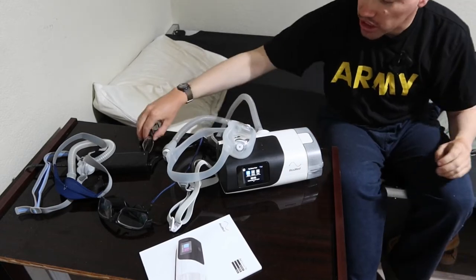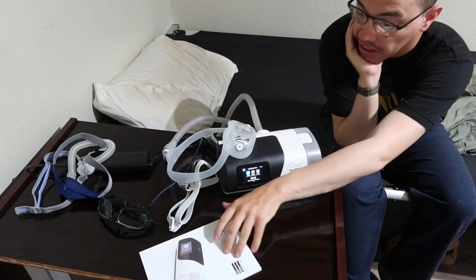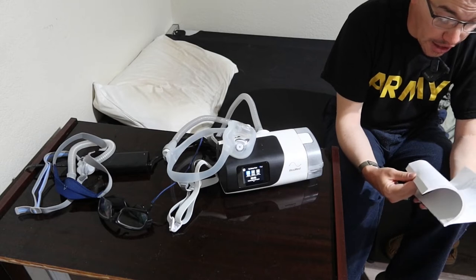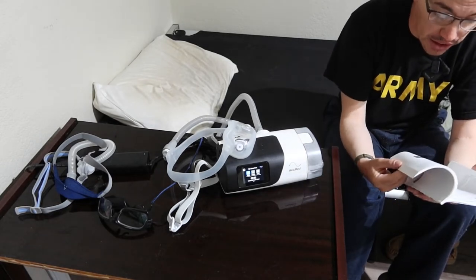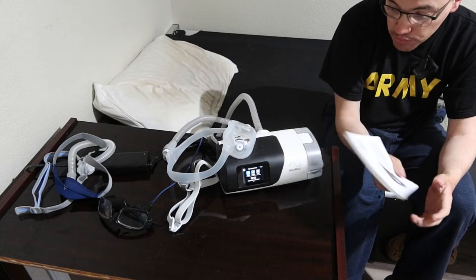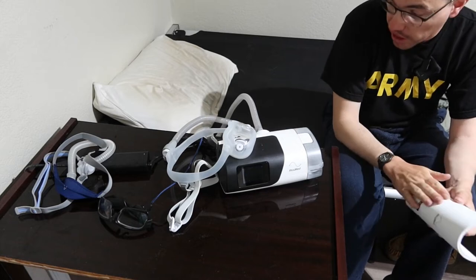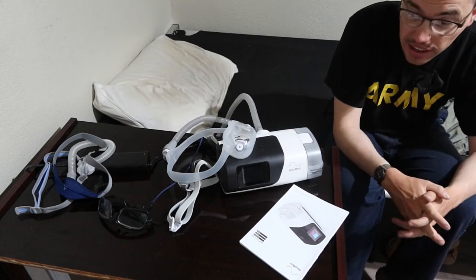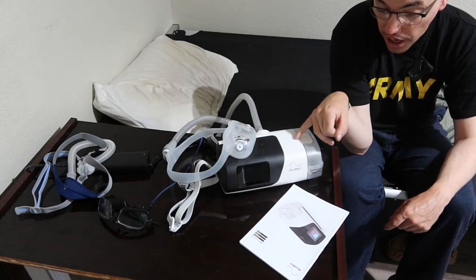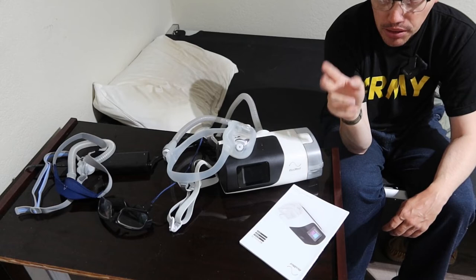That's the information on what features you have with the AirSense 11. This automatically syncs to your doctor every single night so they can keep track. You have to use it at least four times a week, four hours a day. It is Bluetooth, so I can pair it with my phone to keep track — but it only tracks how often you use it and how many times you have breathing problems. It does not track how much sleep you get. That's a very big misconception.